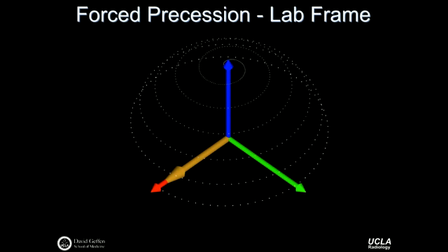The B1 field is much, much, much smaller than the B0 field. And so in the actual physics of these systems, we're going to precess around at megahertz frequencies, but we're only going to precess into the transverse plane at much lower frequencies. So precessing down in the kilohertz range and precessing around in the megahertz range. So big orders of magnitude difference there. Okay, so forced precession in the laboratory frame, a little bit complicated.